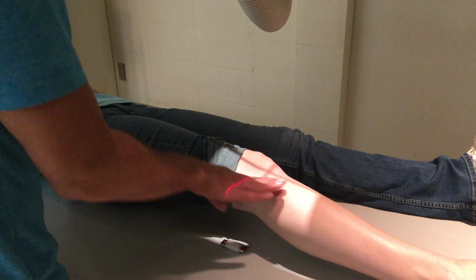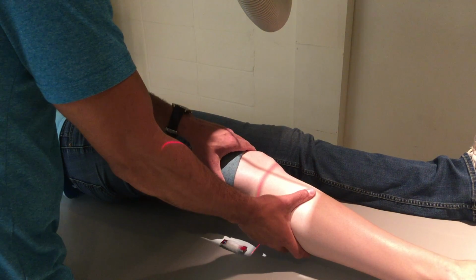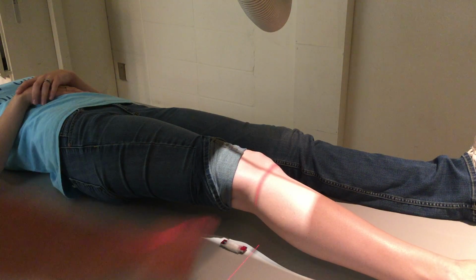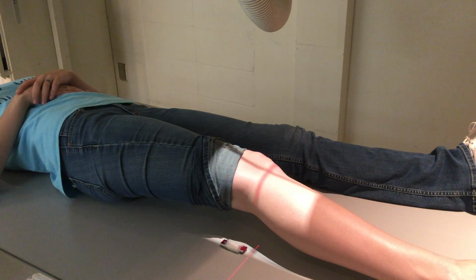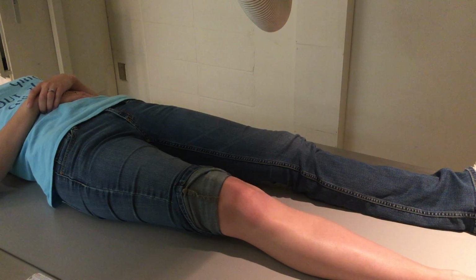And so the head just kind of sits at a funky angle. If you can visualize it as you roll in, you'll see it, but it takes quite a bit to get it. Then just make sure you haven't clipped on the inside, because that could be awkward to see. Make sure you're over bone and not soft tissue, and that's going to be your medial oblique. Okay, go ahead and relax. It's a little bit uncomfortable, right? A little bit. And then the last one is your lateral.